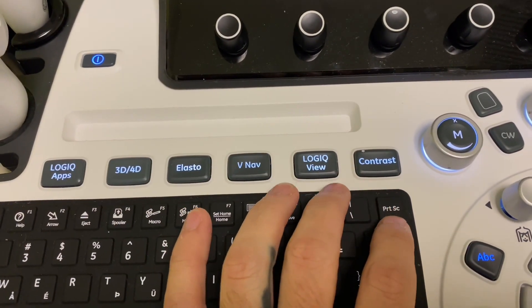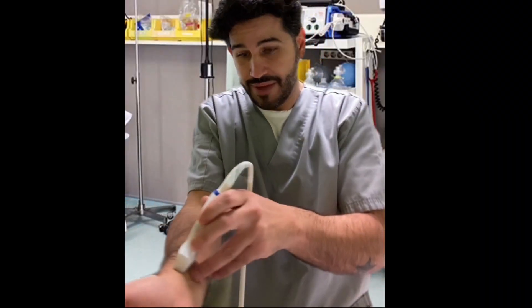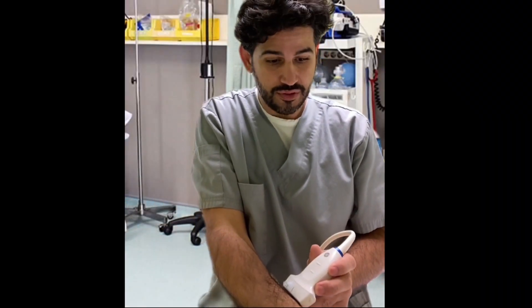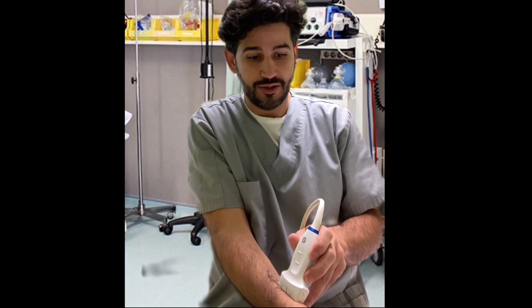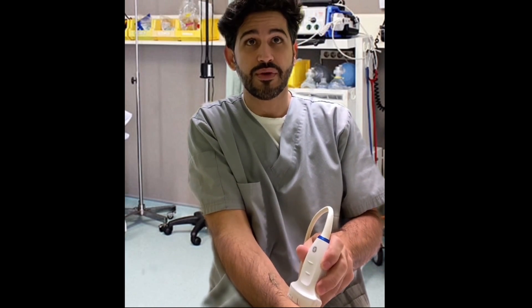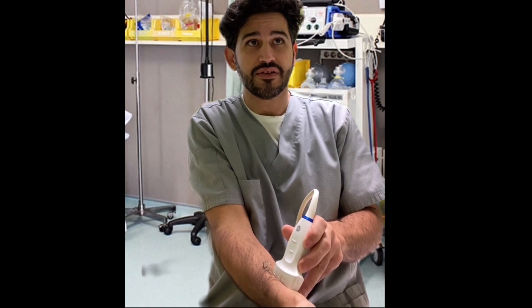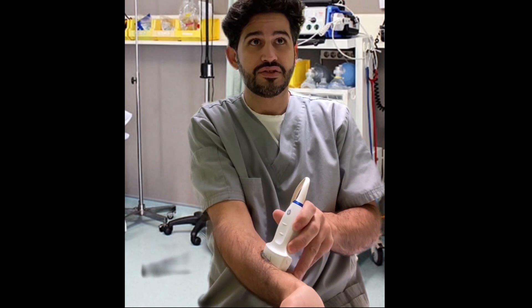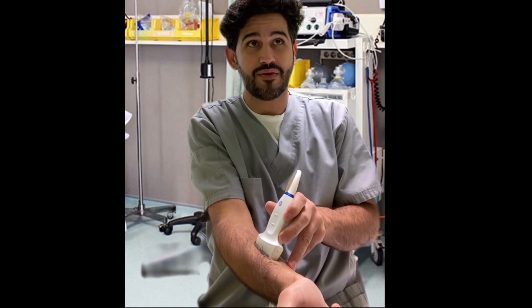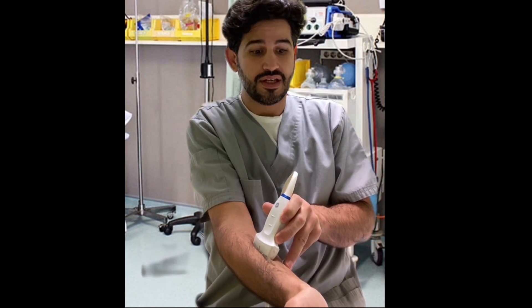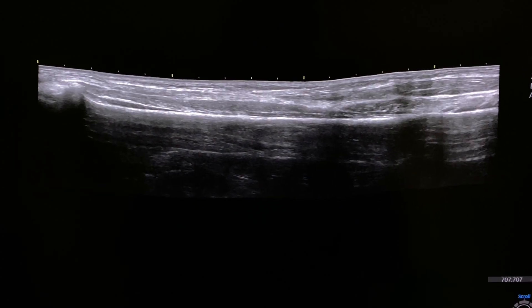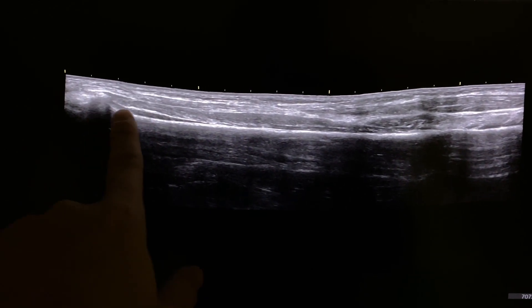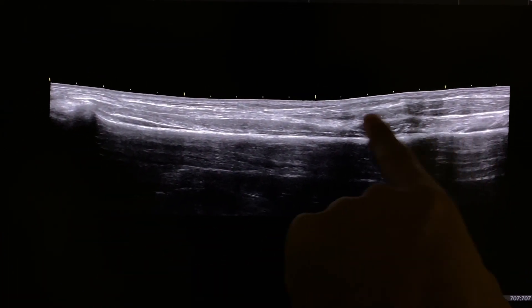All right, so if you want to do a panoramic view with the Logic View, you gotta find your spot, press the L button. All right, I'll use the end of my radius there, and then you just track nice and steady. You can kind of fix it as you're going along. This is just an example, it's not gonna be my best panoramic. And then when you're done, press the R button, and there you go. You have a panoramic following the radius and the musculature.